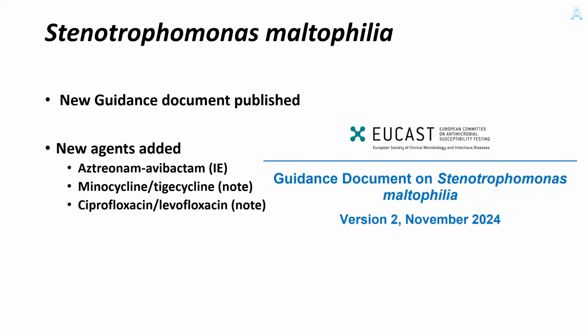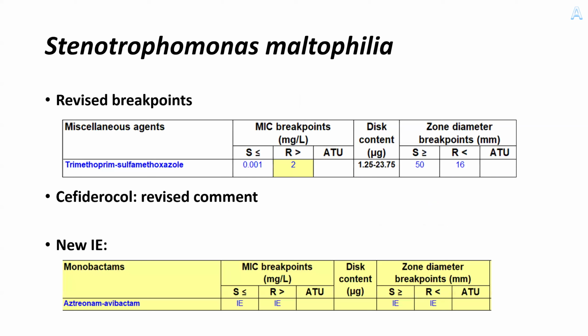Yes, we can go to the next slide, Karianne. But we will start out with the revised breakpoint for trimethoprim-sulfamethoxazole, where the MIC-R breakpoint has been changed from 4 to 2 this year. There is also a revised comment for cefiderocol, as I mentioned earlier, and aztreonam-avibactam now enters the Stenotrophomonas sheet as an IE, insufficient evidence.